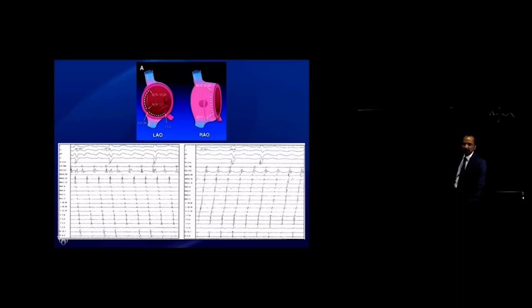A lot of the early work with flutter ablation involved right atrial mapping. And we still rely on that to get us an idea when we're not sure what type of flutter it is. This usually involves multi-electrode catheters. And once we get experience with multi-electrode catheters, using any kind of basket map, quick map of the atrium, we kind of relate back to what we learned from multi-electrode catheters. One important area is the free wall of the right atrium. Is that activation counterclockwise or clockwise, down the free wall or up the free wall?